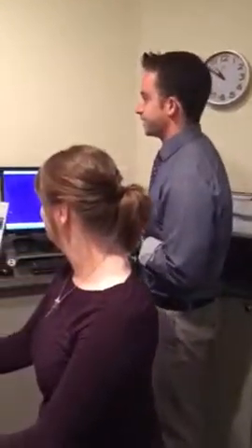Dr. Isaacson, and he's going to explain a little bit about our OCT test. Good. I'll wait till it's scanned and everything.